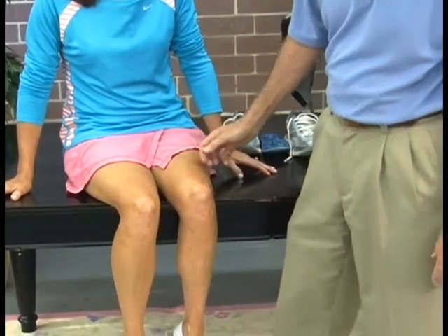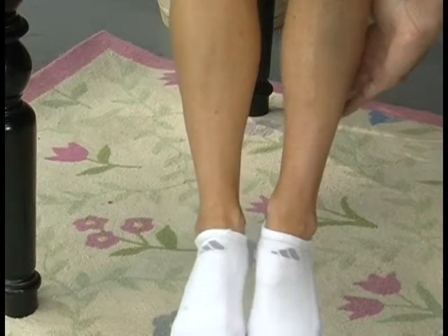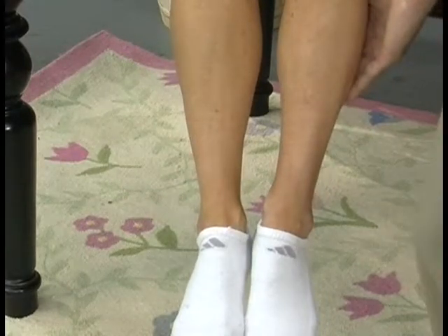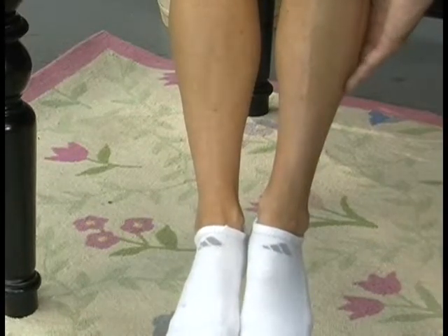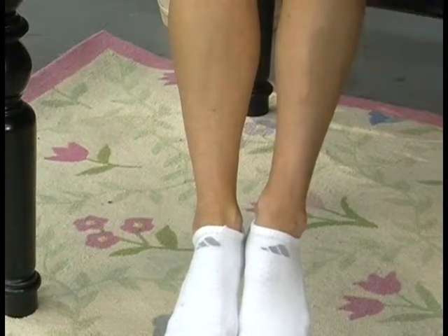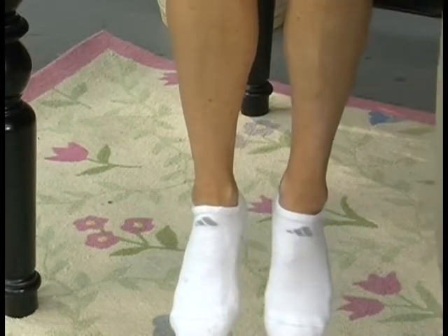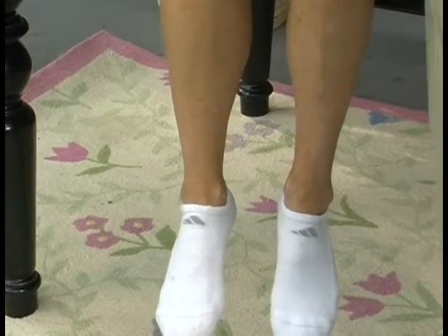What you see is that the lower leg is smaller because she doesn't have a normal push-off. Since she's been in the brace, this leg has gotten a lot bigger because she's using it more normally — it was very much smaller before, but it's still a little bit smaller. You see good development of the thighs and hips that's fairly equal, because of more normal running form and walking form.